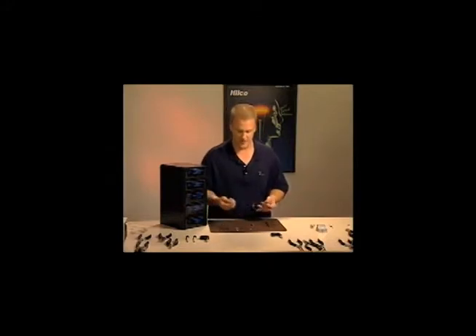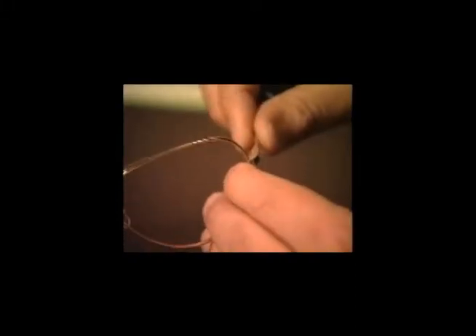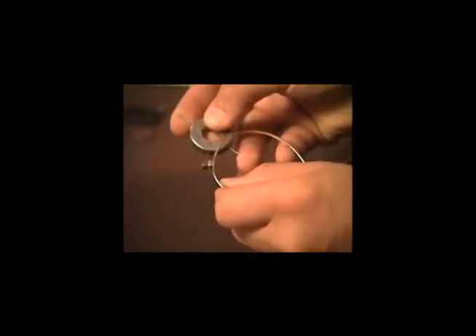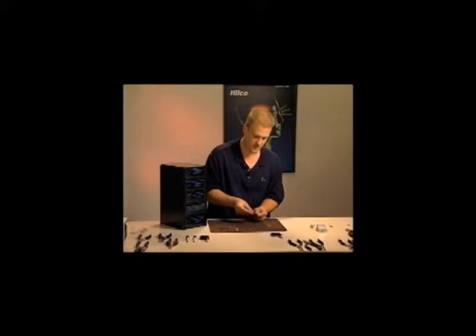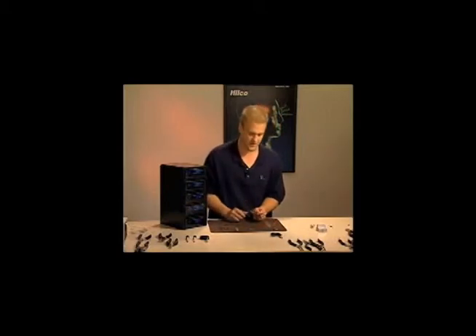Here we have a temple and a frame front where we have to find a replacement screw. Now, what I need is the diameter of the hole on the bottom. That's where the screw is going to thread in. So I'll take this pin gauge and pass the pins through. Let's see, we'll start at 1.2. I will pass the pins through until I find one that fits snug. 1.2 is too small, 1.27 is too small, 1.4, that's pretty snug, 1.5, it's a little large. So it looks like it's going to be a 1.4. Now we know the diameter of the screw.